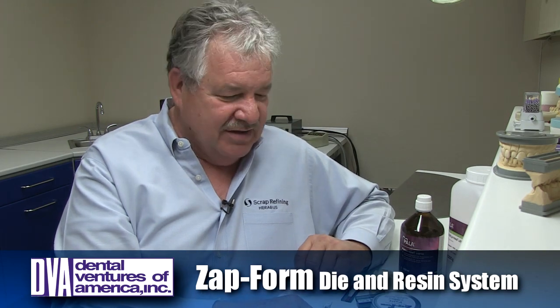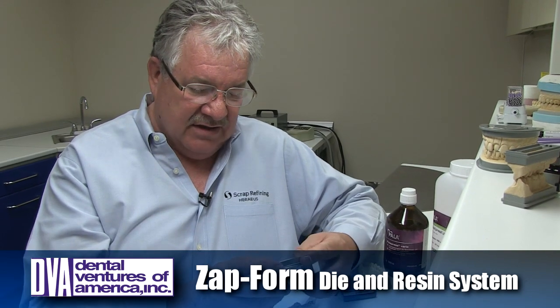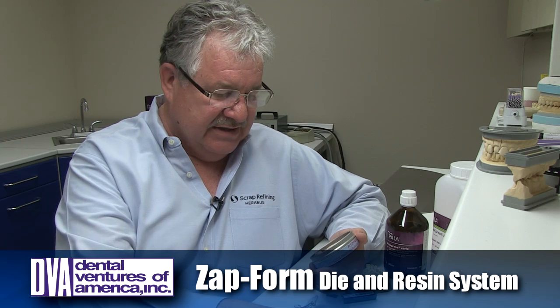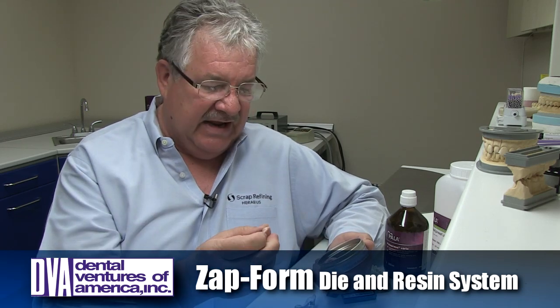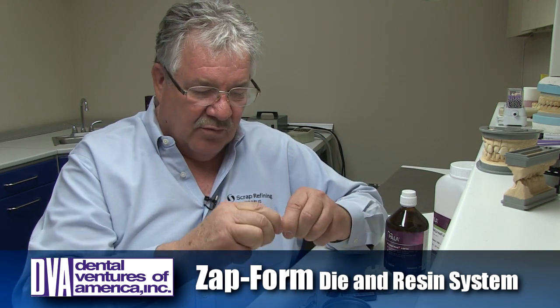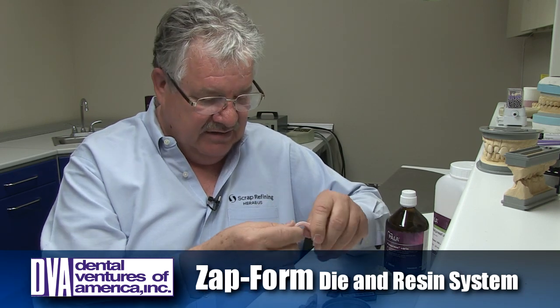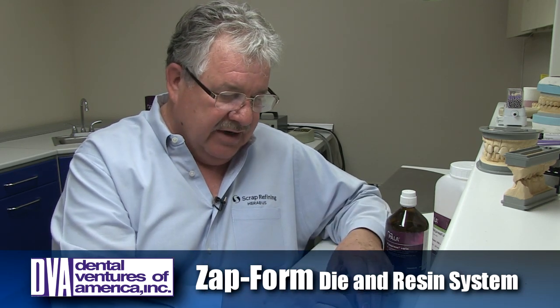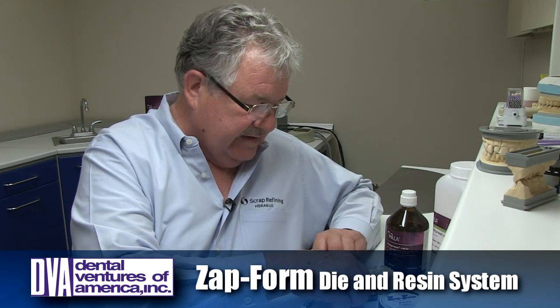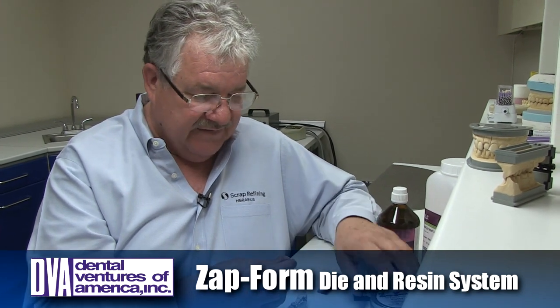The way it works is we use what DVA calls Zapform Putty. You'll find all kinds of uses for this material. So instead of using wax on these types of cases, we use a putty. It's a pliable, flexible material that'll hold the teeth in position just long enough to make a matrix. You can use it for dams, you can make flippers, you can make bruxer splints, and all kinds of fun stuff.